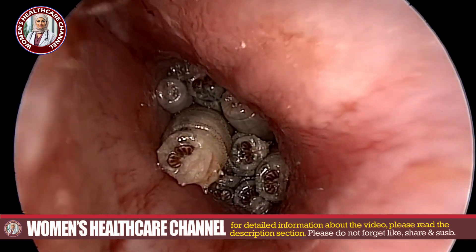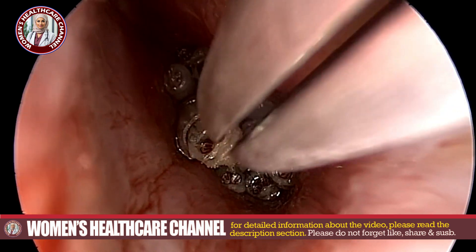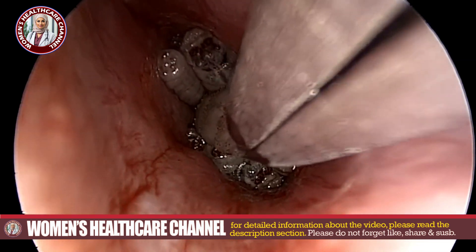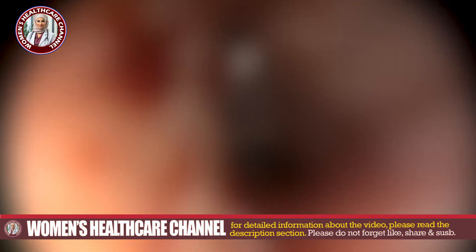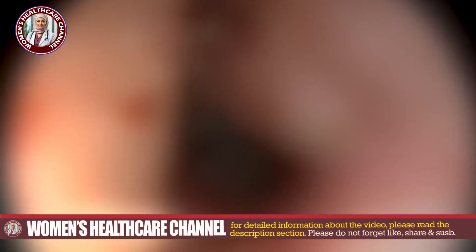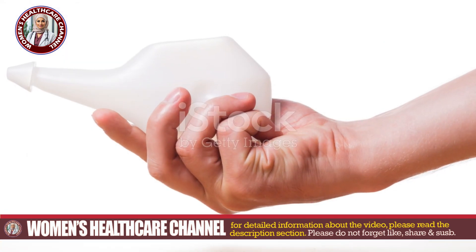For the removal process, insert an ear speculum gently to widen the ear canal for better visibility. Carefully grasp each maggot with forceps or tweezers and remove it. Take care not to damage the ear canal or push the maggots further in. If any maggots are deep or difficult to reach, use a suction device. Repeat irrigation as necessary to keep the area clean and flush out any remaining maggots.